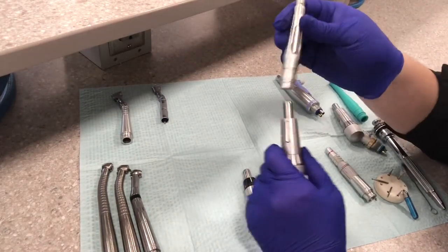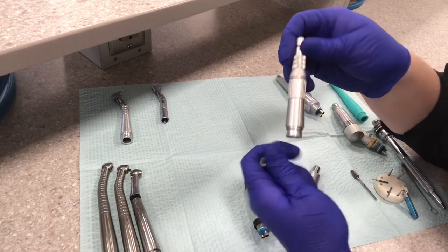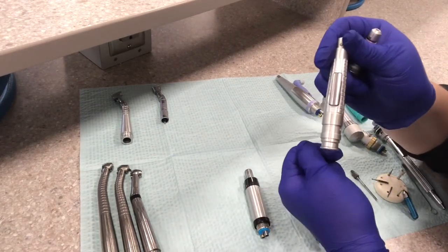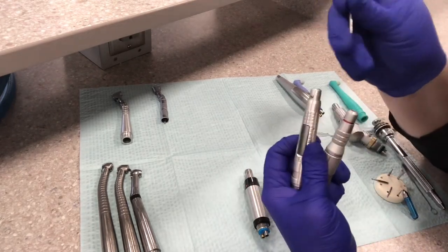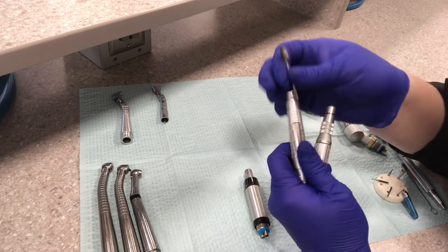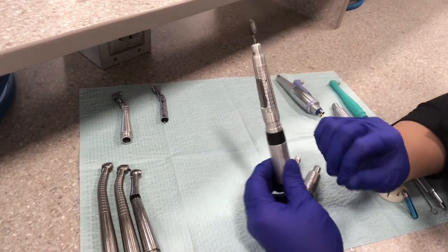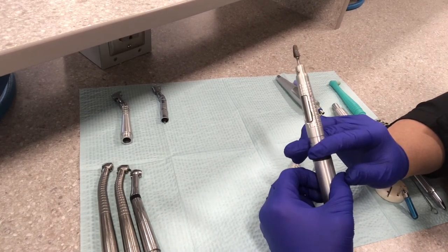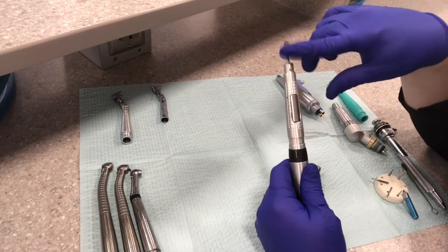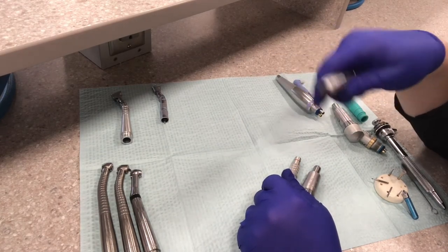So then our straight attachment — this has a lever style here. This one is a twist lock with a little part that you twist, and then this one has a lever that you push down to attach either the straight acrylic burr or handpiece burr. You use this with the lab engine. This would never be used intraorally — in a patient's mouth. This would be used chairside to adjust maybe a denture, a partial, a night guard, a retainer, something like that. This burr never goes in a patient's mouth — it's way too big to use intraorally.